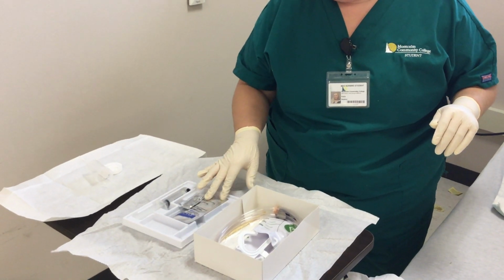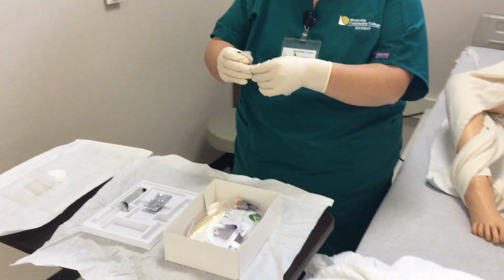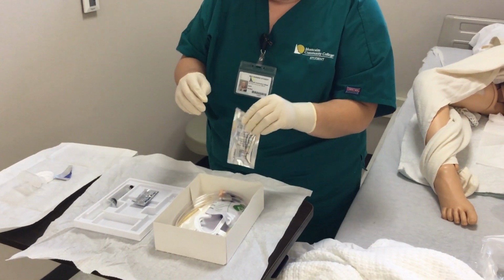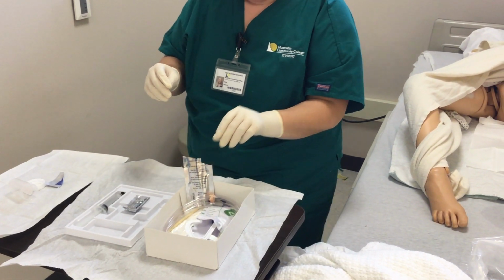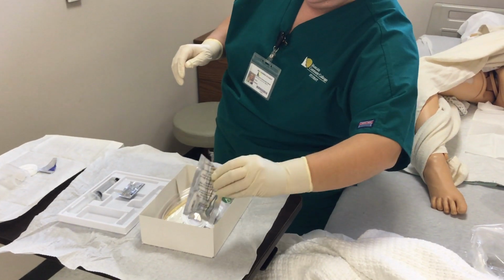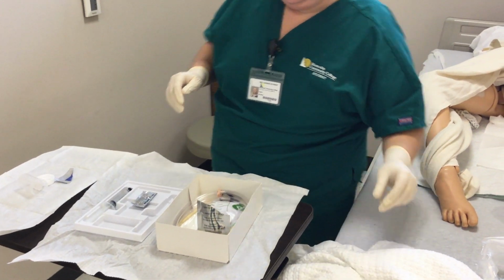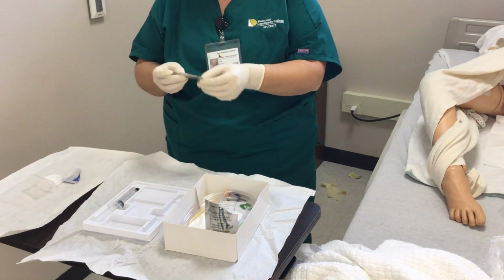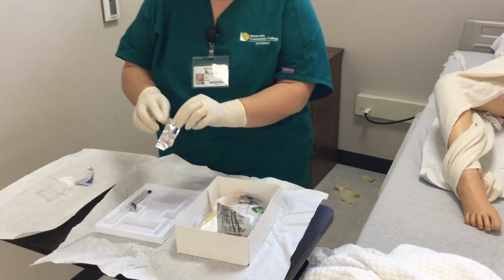So now that's done, I'm going to open my kit. Don't need those. Alright, so to begin, I'm going to open this up. Be very careful not to.